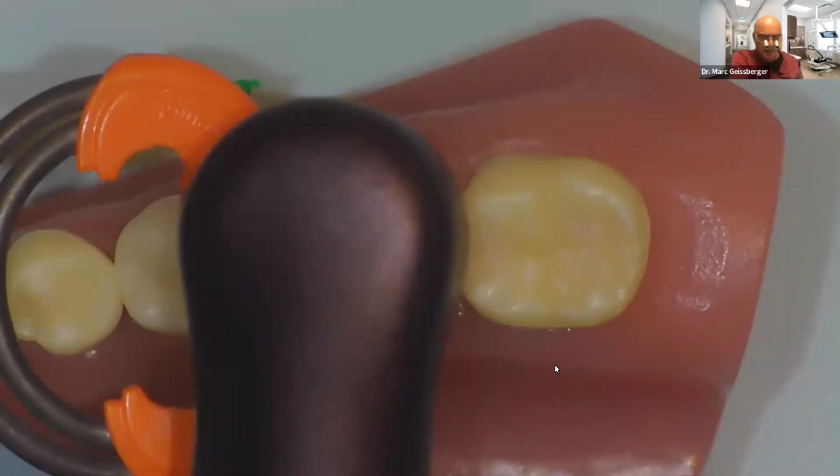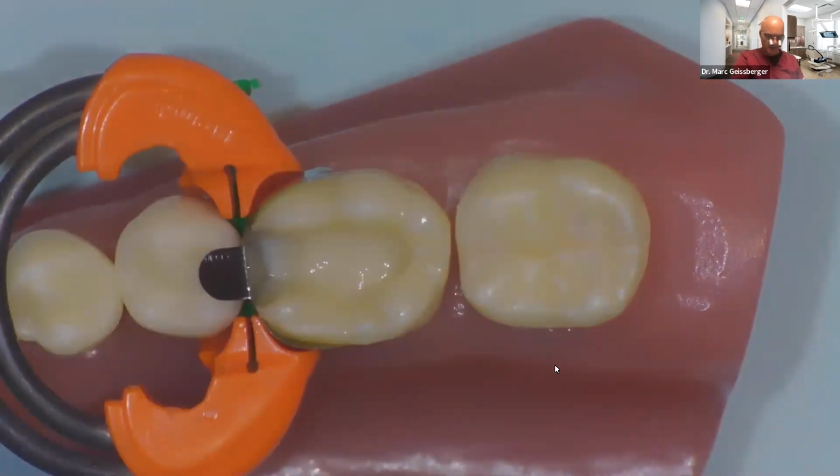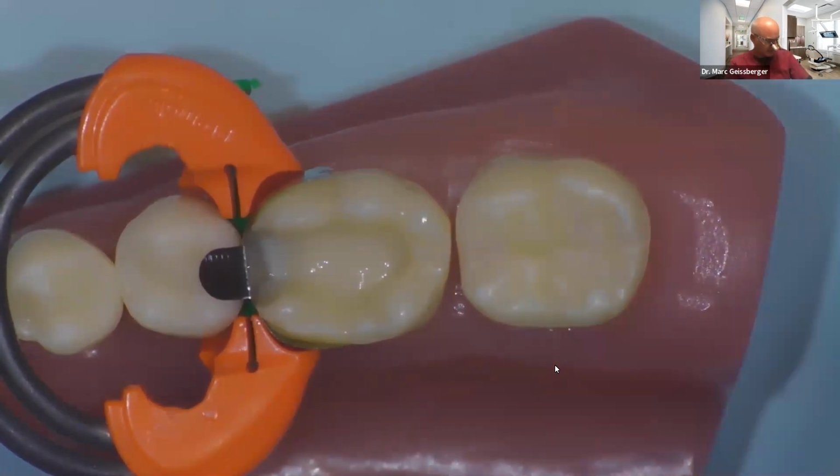So with that said, I'm going to switch out my composite gun. And I want you to know that in clinical practice, my dental assistant does all of the curing. I don't. And she's been trained really well to know right where to put the light to make this efficient. But with that said, I'm my own curer tonight because she's not sticking around past 5 o'clock, and I don't blame her. She's got kids and a family to get home to. So I'm on my own tonight. So I'm going to be my own dental assistant.